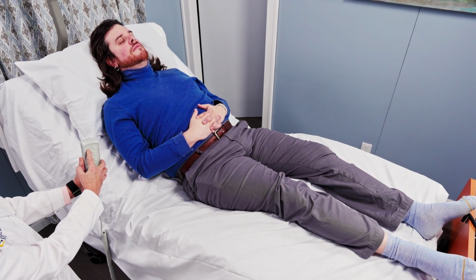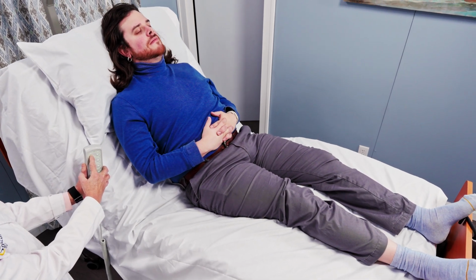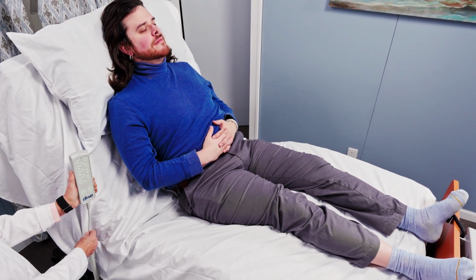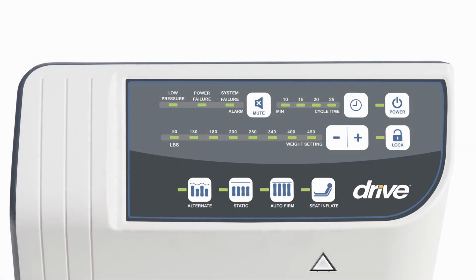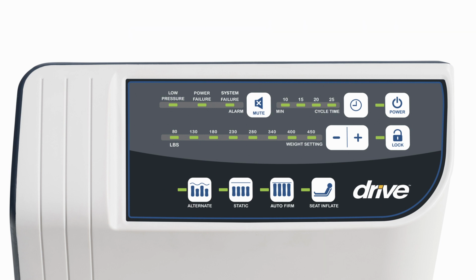When the head of bed is elevated 30 degrees or higher, we recommend engaging seat inflate to prevent possible bottoming out and to provide additional support to the patient during head raised or Fowler position. The seat inflate button can remain on indefinitely if desired. One of the most useful features is auto-firm.